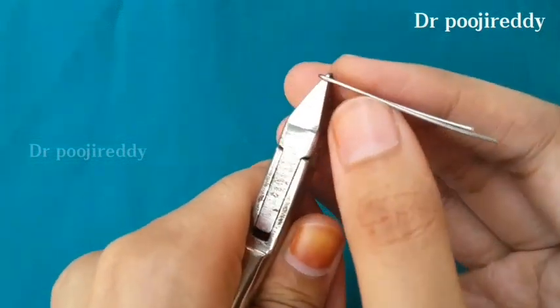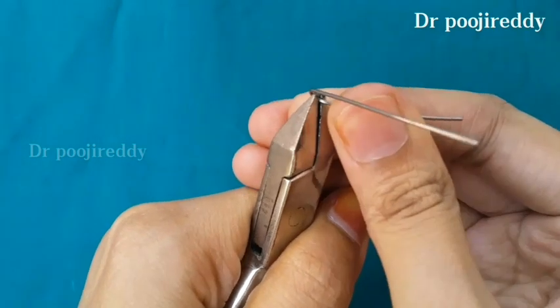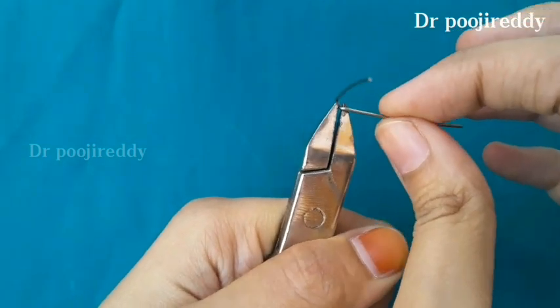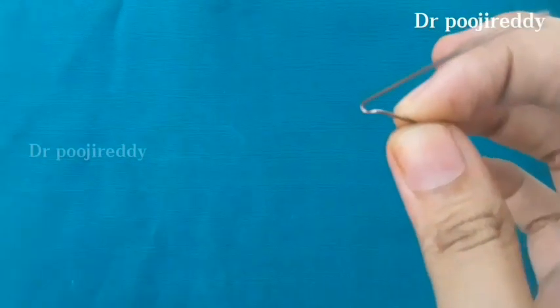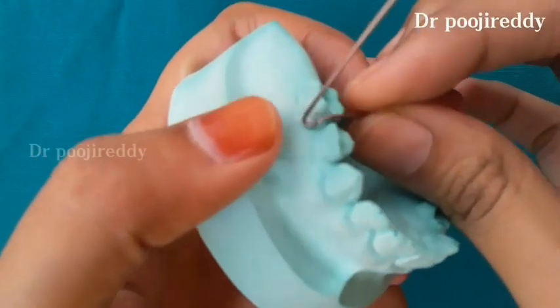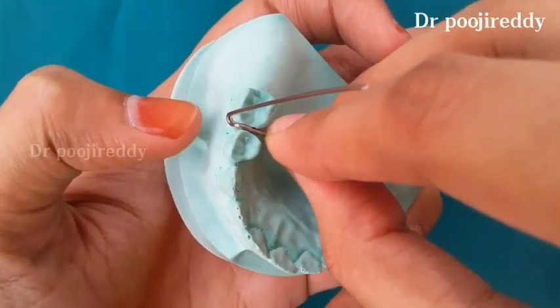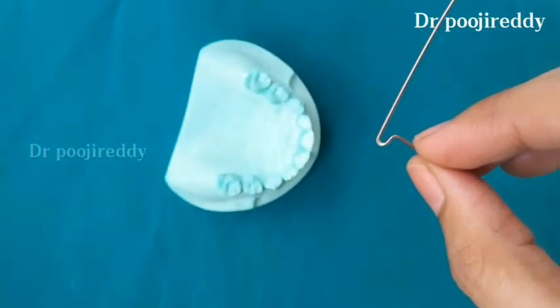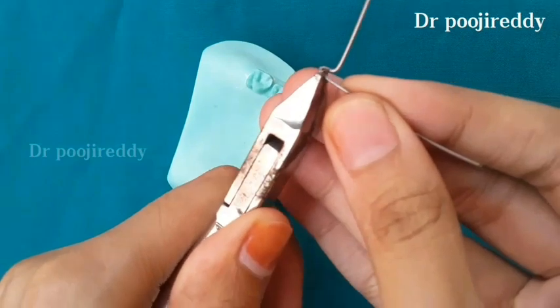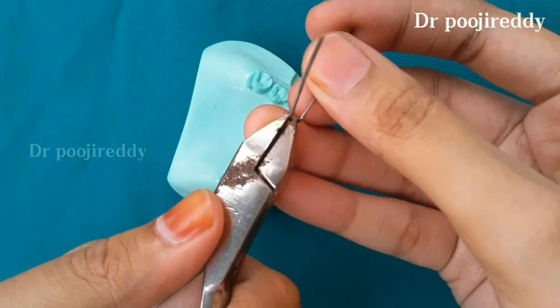Place the beak of the Adams plier on the tip of the U-shape that we have made already, as you are seeing right now, and then give a 90-degree bend. This is how the bend looks like. In the same way, on the opposite side, place the beak of the Adams plier on the tip of the U-shape and then give a 90-degree bend, as I am showing right now.